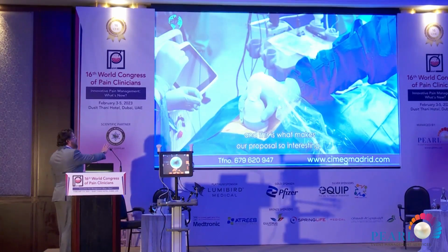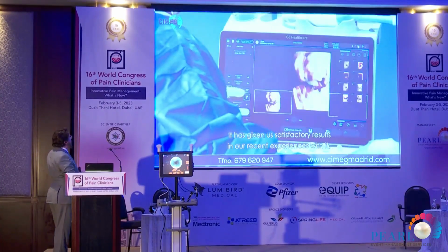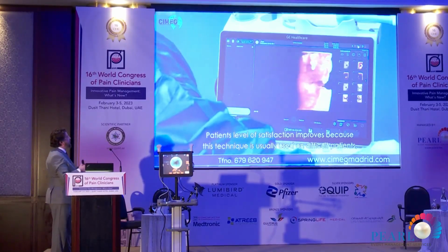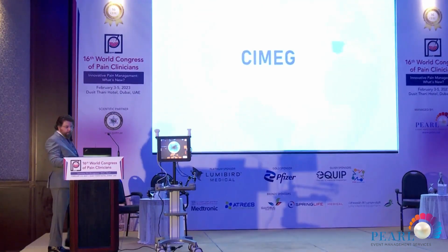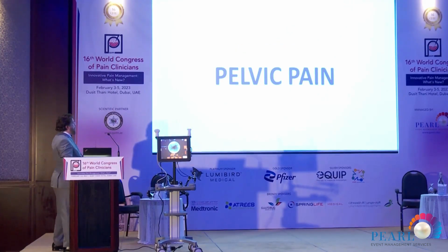This is my advanced ultrasound. This is a combination, not only this ultrasound, I combine another ultrasound for 5D and trans-illumination, because I am a fan of advanced ultrasound. This software and this technique are used in cardiology to identify the principal alteration in the heart. And this is more important because it's possible for you to see the whole and produce the ice ball in the tissue.